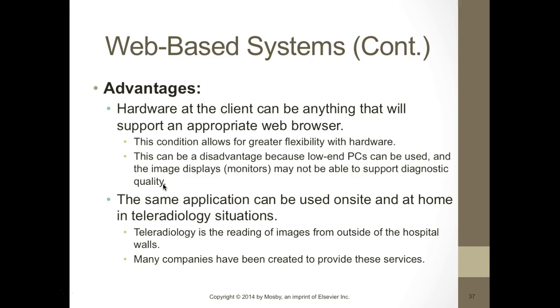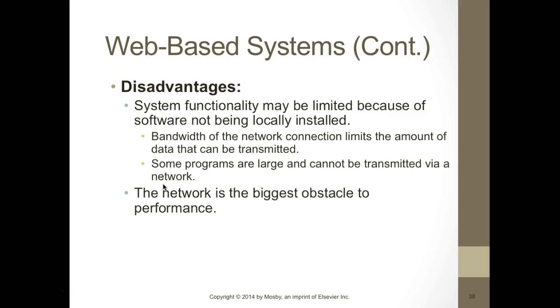So the same applications can be used on-site and at home in teleradiology. Teleradiology, if you guys don't know, is reading images outside of the hospital. So many companies are out there, Nighthawk, and there are several of them that will do STAT rad reads offsite. The disadvantage is the system functionality may be limited because the software is not locally installed. Also, the bandwidth of the network connections limits the amount of data that can be transmitted.